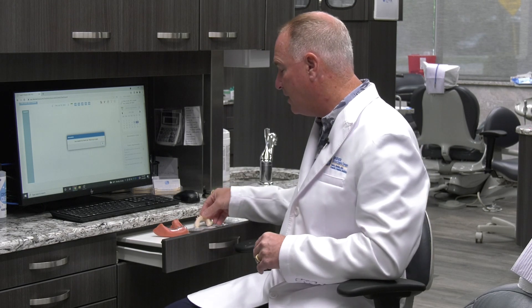But now we're two decades later and we're doing CT guided stents. We're making 3D models and then we're fabricating the surgical guide to go over that model so that it's a very, very precise surgical guide stent.